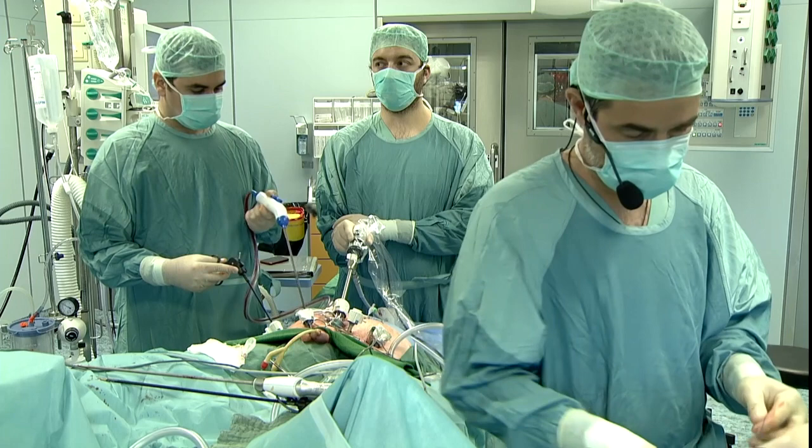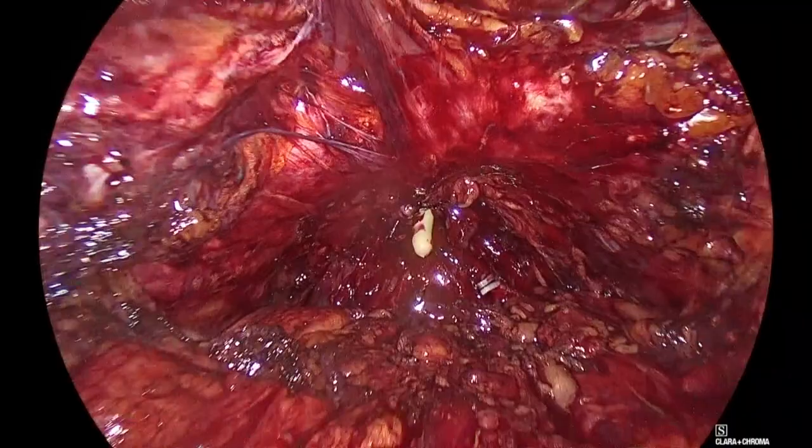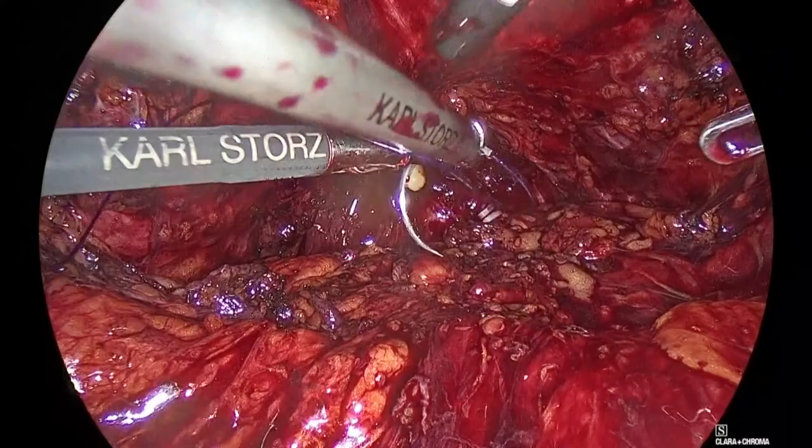If you can show us that, if we have a view of you tying the knot now, Evangelos. I will show you inside. You will be able to understand it. So it's a UR6 needle on a PDS. Do you ever use a Rocco stitch? No. Aspirate.